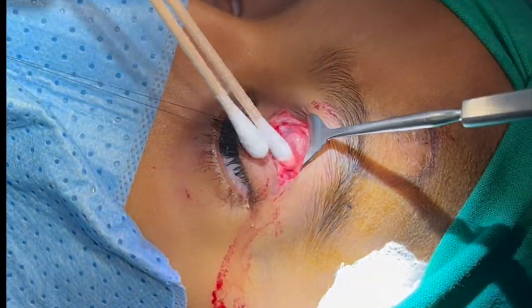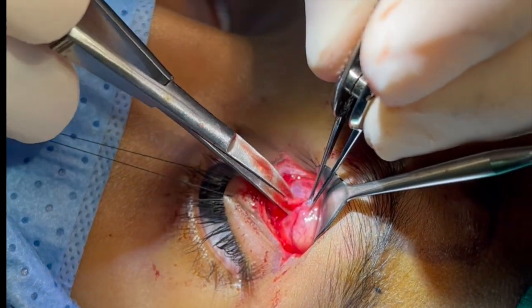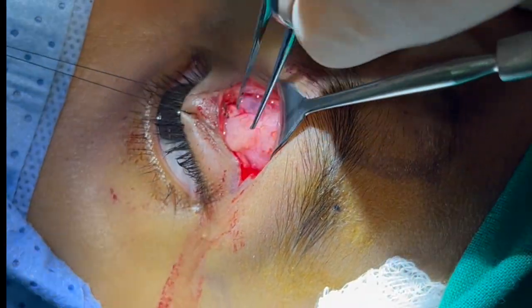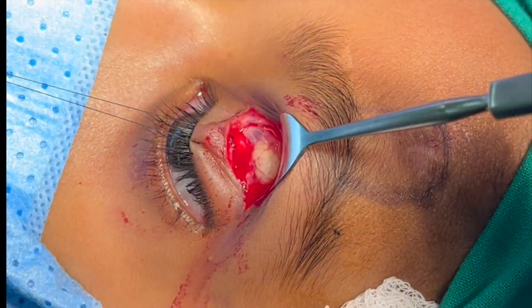Here we can see the central fat pad and septum overlying the levator muscle. We are opening the septum and dissecting the fat off the underlying levator muscle, and here we are excising some of the fat.